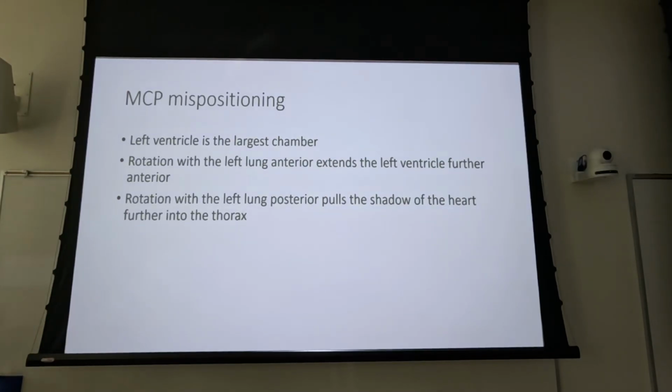that. So the reason we do left lateral is the left ventricle is larger than any other part of the patient, unless you got a patient who has dextrocardia, right, or situs inversus, and then it's still the same anatomy, it's just flipped around. So there are times to do a right lateral, and those will be those cases, but in most cases, your patient's not going to tell you that. You're not going to find out that they've got a flipped heart until after you've already shot the PA. So unless you look at your image before you shoot the lateral, you're just not going to know that, right?